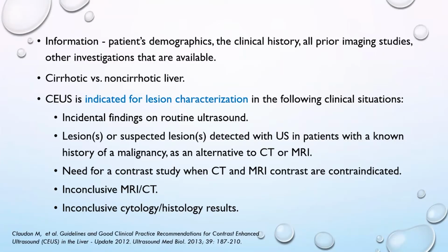Remember that one of the most important parts regarding the use of contrast enhanced ultrasound, as compared to the other imaging techniques, is that you have the patient, and it's very good that you know, before you are performing the contrast studies, the patient demographics, the clinical history, all other pure information that you have, also imaging techniques.